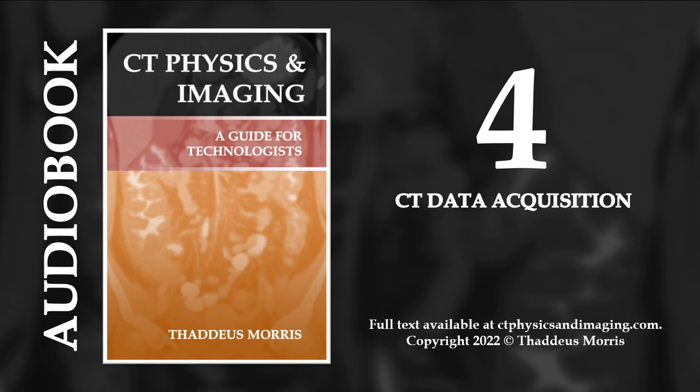Acquisition rate. How fast is a CT scan? It depends entirely on the input variables set by the technologist. There are 3 simple ways to decrease the total acquisition time, all of which must be balanced with image quality. Rotation time. The time required for scanning can be decreased simply by decreasing the tube rotation time. The upside is a faster scan and a potential to decrease patient motion artifacts. The downside is an increase in image noise, assuming there's no change in mA or the number of projections per tube rotation.